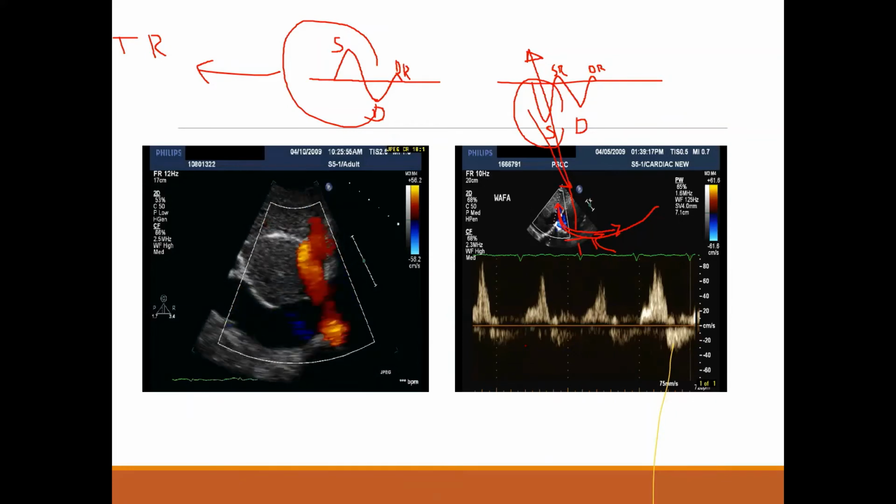So the reversals in the pulmonary vein for the MR and in the hepatic vein in the TR are specific but might not be sensitive, and they are great in ruling in severe MR but not in ruling out. They are great in positive predictive value but not in negative predictive value. So you have to remember this about the reversal.